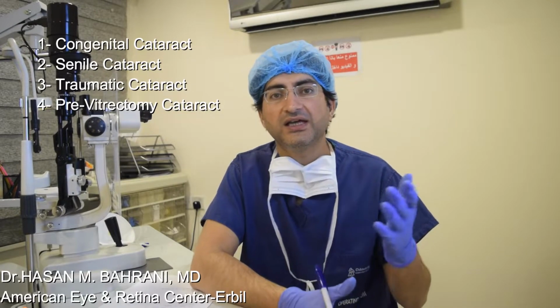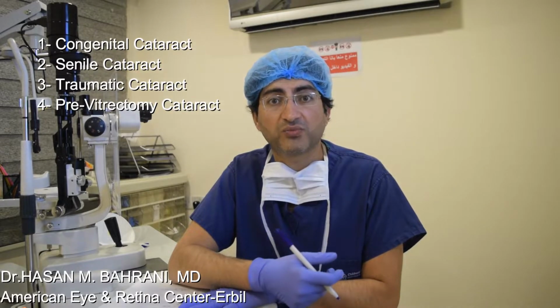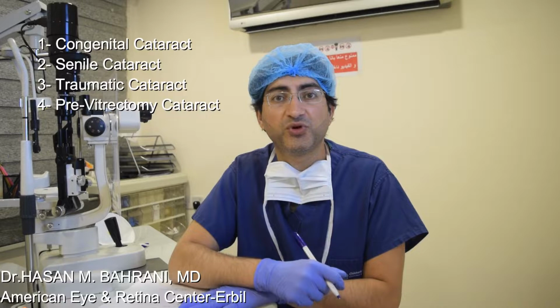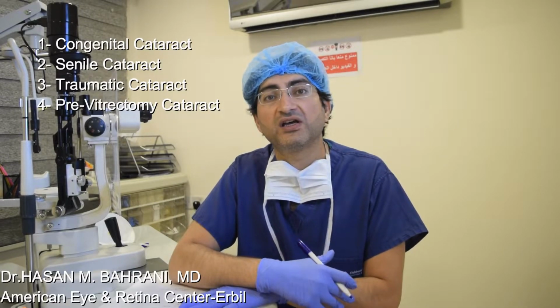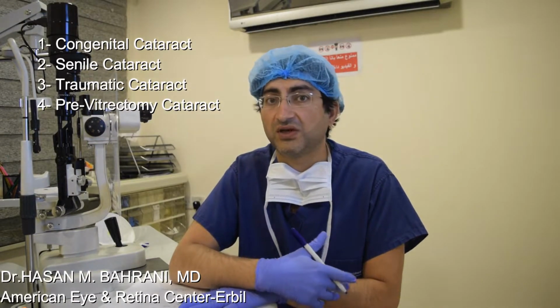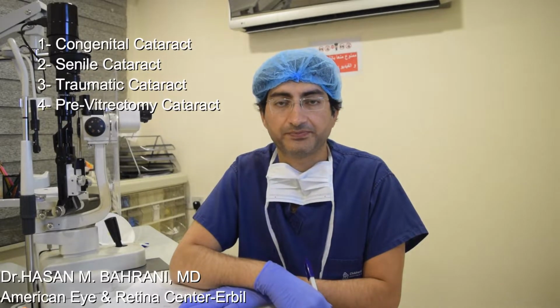So every case has a different planning. In these cases of pre-vitrectomy phacoemulsification, I usually put a suture in all incisions. When we do a lot of manipulation during vitrectomy, we may add a buckle. You don't want a collapse of the anterior chamber.